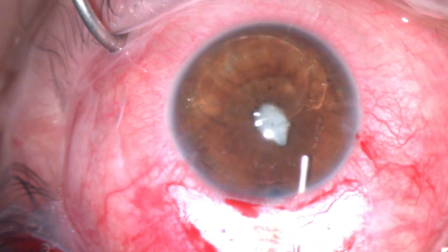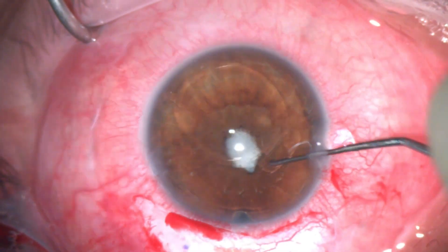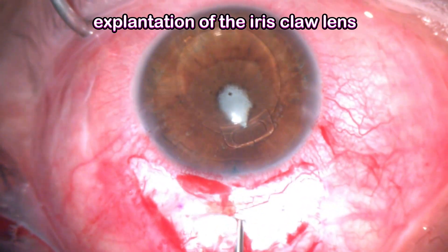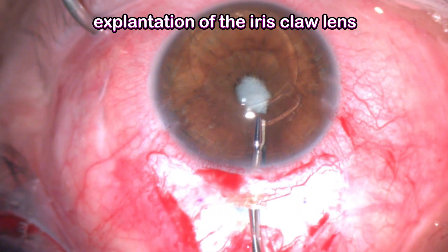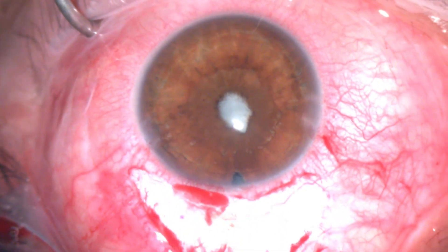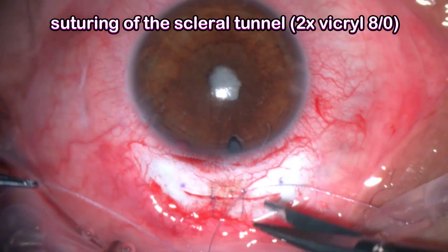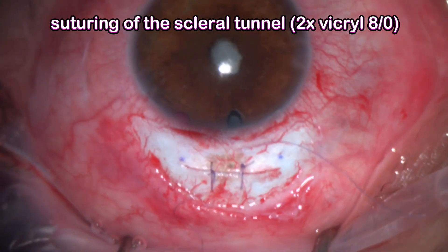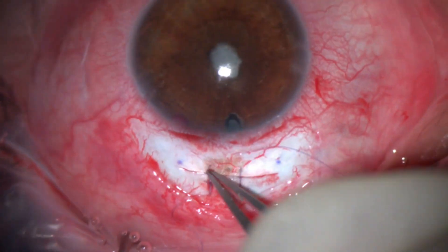We slightly rotate the lens along the axis of the main incision for easy removal. This lens is about 6 millimeters and it's a hard lens. After removing the lens, I sutured the scleral tunnel incision with two Vicryl sutures.